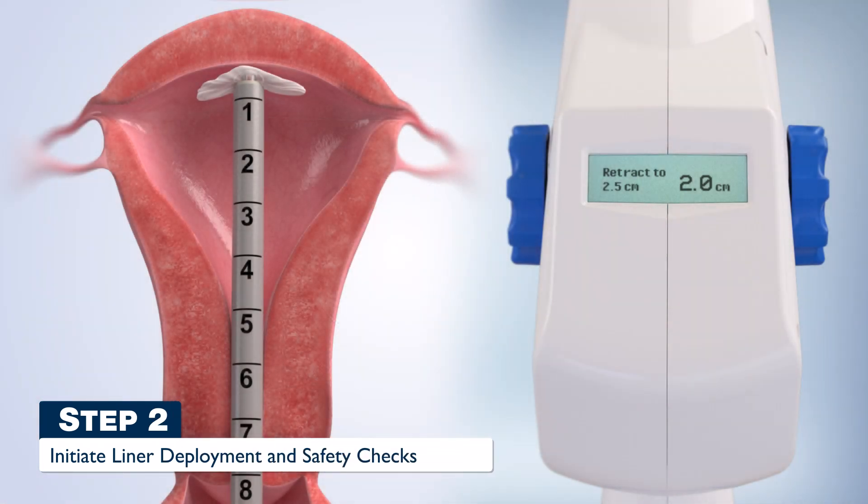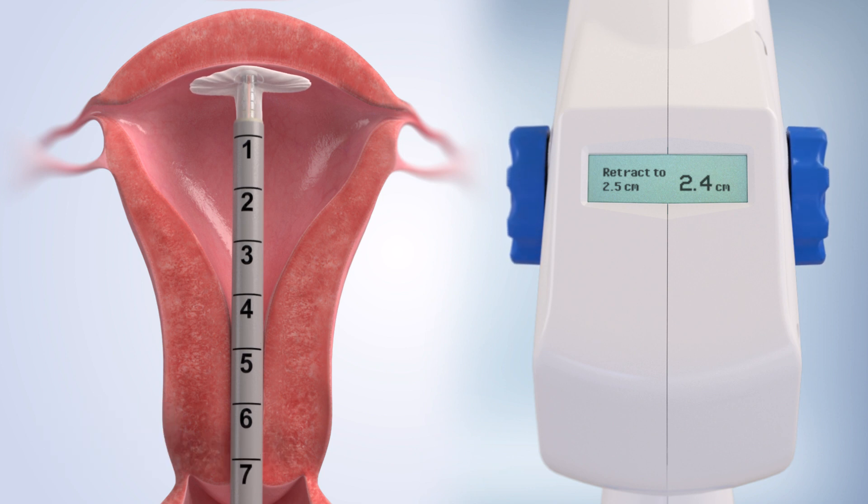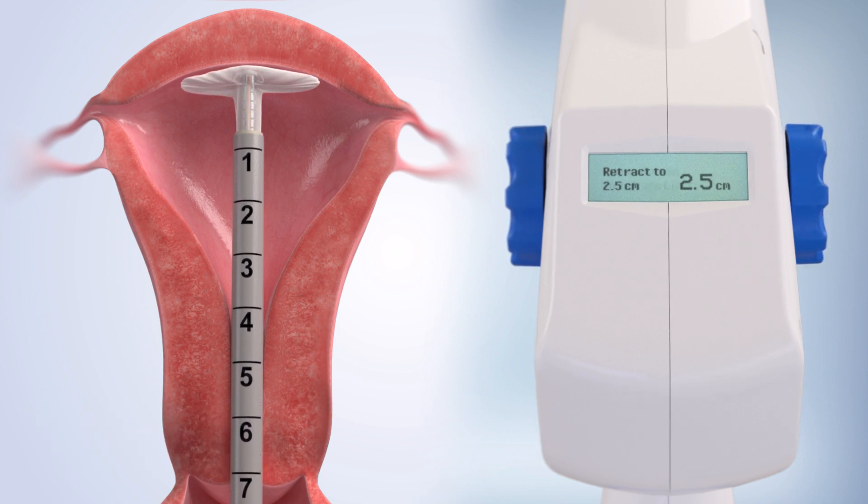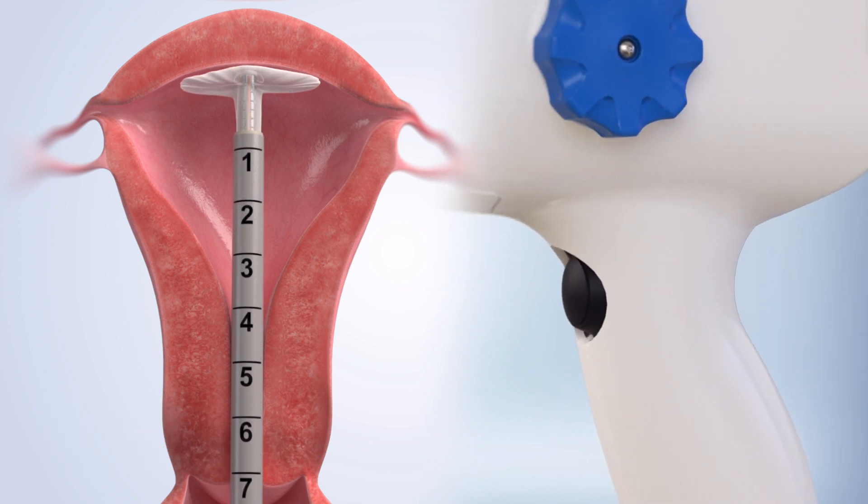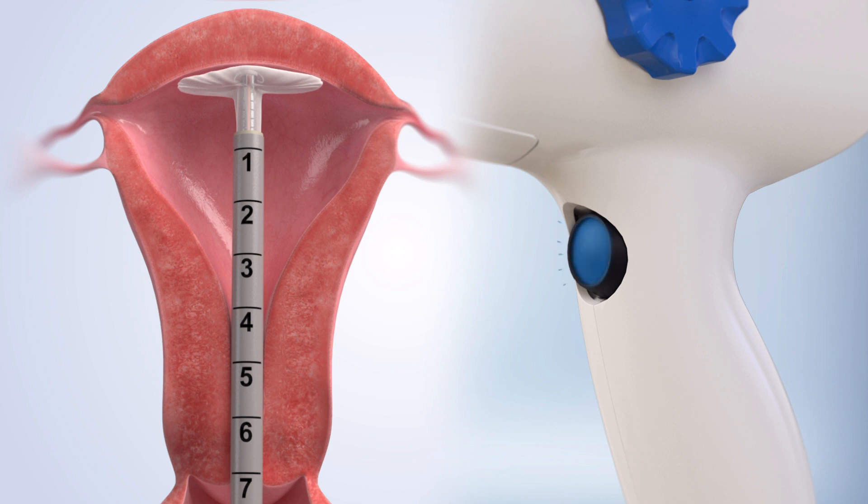Step 2. Turn the sheath retraction knob until the LCD screen displays 2.5 cm. Press and release the button to gently deploy the cavity conforming liner and begin safety checks.